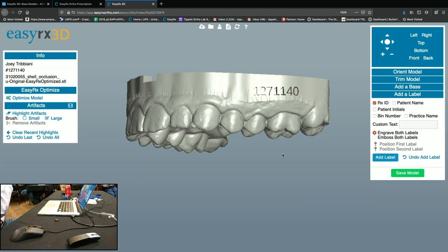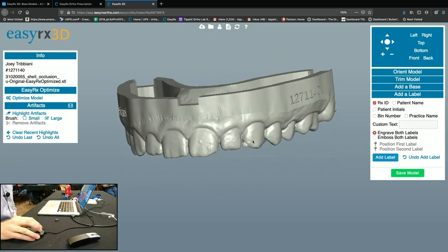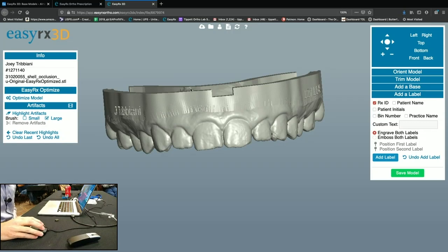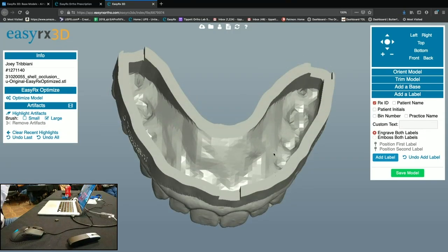Because as it builds, you're going to have some unsupported areas that'll collapse before it gets to the end point. So when it builds upside down, so it prints like this. So it's going to do that first layer like that. So as it gets to this layer, it's like putting the keystone in an arch. You don't have that keystone yet. So you've got to put a support as you build your arch. Otherwise it'll... No, I don't dare.